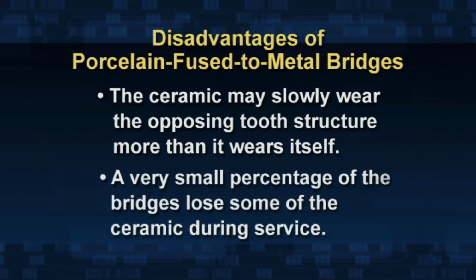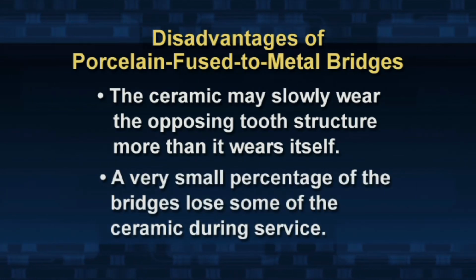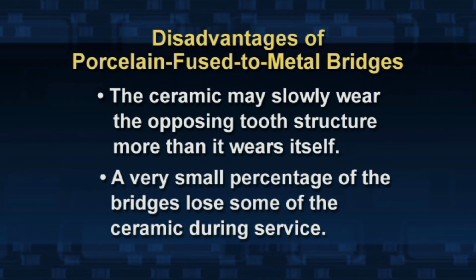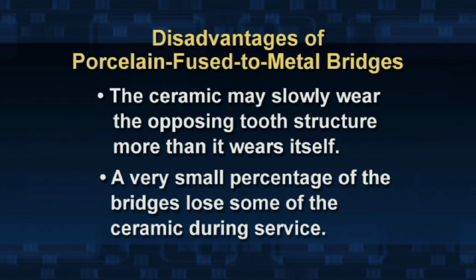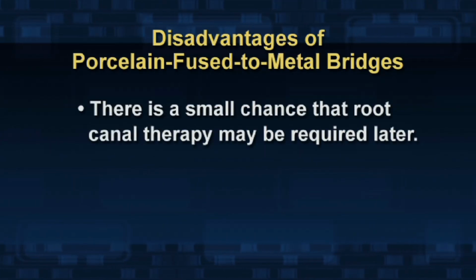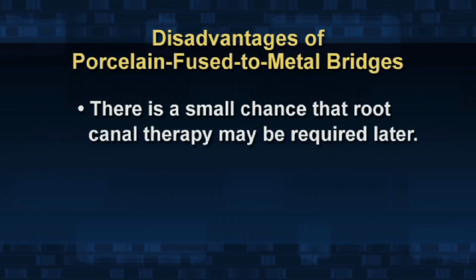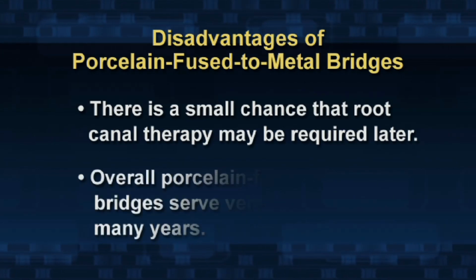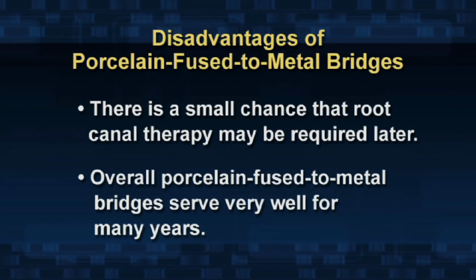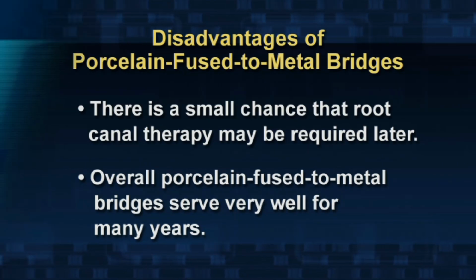A very small percentage of porcelain fused to metal bridges lose some of the ceramic during service, but you must traumatize them or in some way break them with force. As with any crown placement, there's a small chance that root canal therapy may be required later. Overall, porcelain fused to metal bridges serve in an excellent manner for many years.